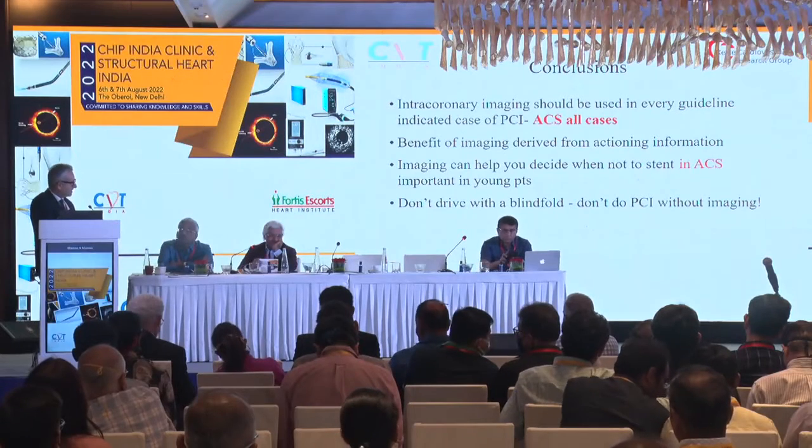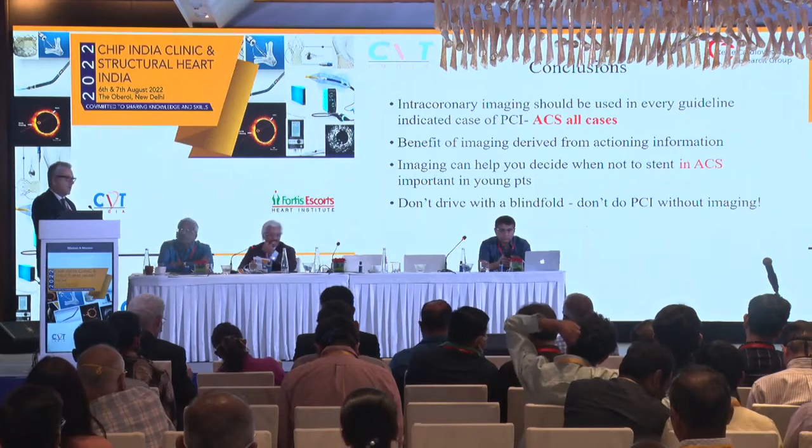You can see that in the case I presented, the lung cancer case, the thrombotic case with a very large diameter lesion, the SCAD case, stenting would have caused harm to the patient. So imaging stopped me stenting those. And I'd say that most people in this room would have stented the type A lesion in the young guy, and most people in this room would have probably stented the right coronary artery in the lady. You wouldn't know that without imaging. I wasn't expecting that. I was expecting just to stent those cases. You shouldn't drive blindfold, therefore you shouldn't do PCI without imaging. Thank you.